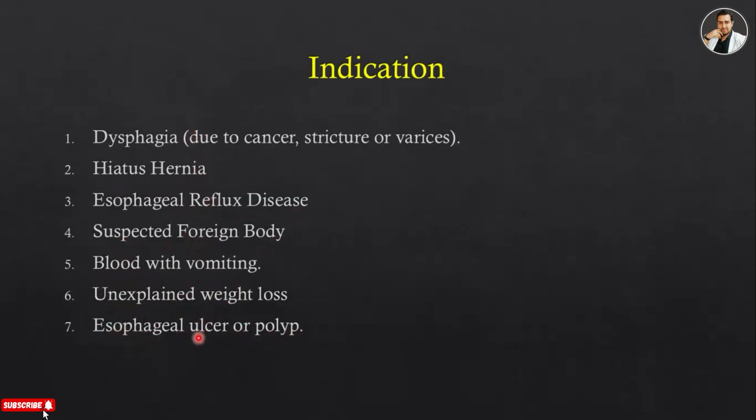So these are the indications for a barium swallow study.